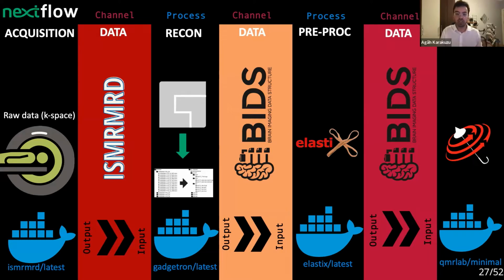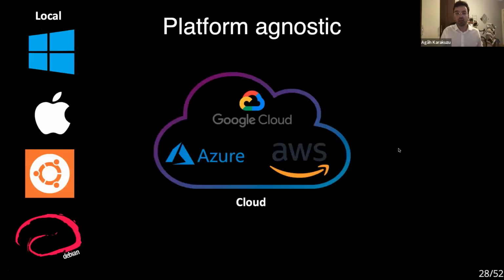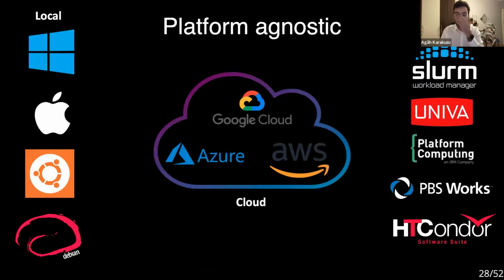in the Nextflow context. So this way, not only the containerized execution environments, which are different from each other, but also the task execution states are isolated from each other. And this is great for spotting problems and debugging them. It really makes it much easier to trace individual processes down to their command calls. It is platform agnostic. You can run it locally or on cloud, or you can easily deploy it to HPC clusters. Plus, it can consume data directly from cloud storage providers.